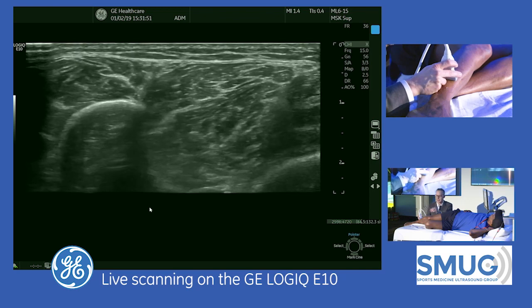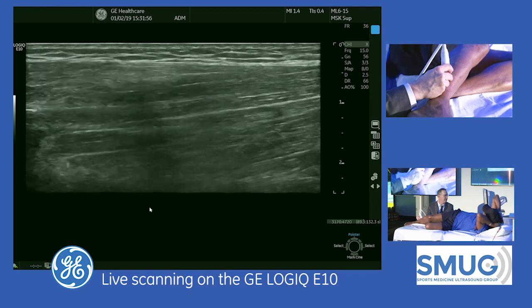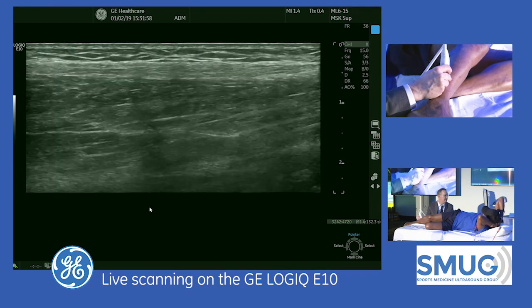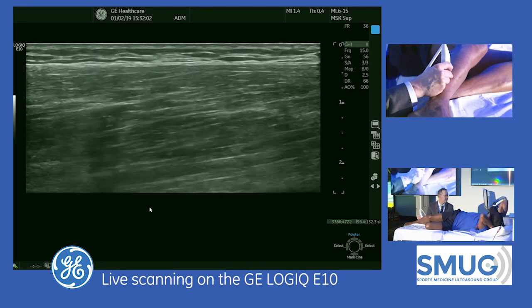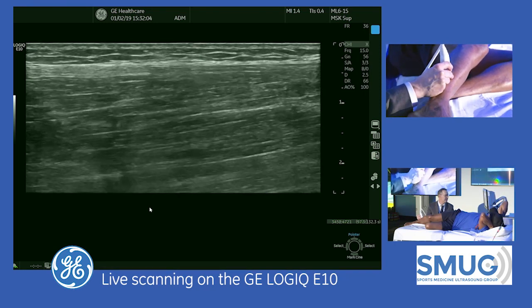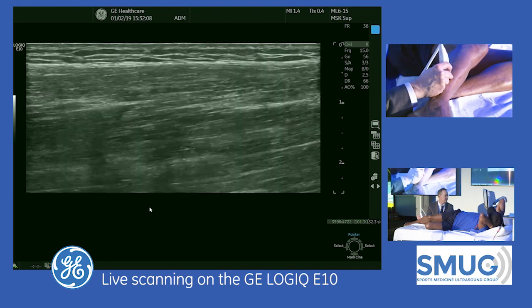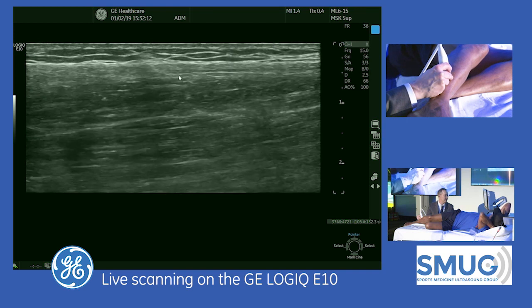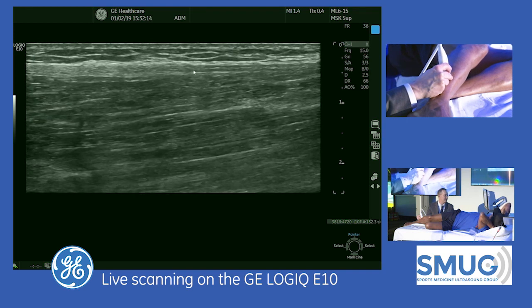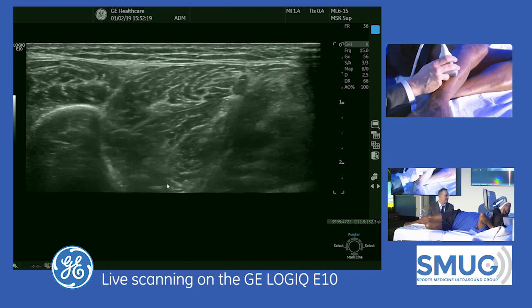You can look at it in long axis, which would show if it were enlarged. But when you look at these tiny nerves in long axis, they almost look like a fascial layer, especially when they're normal. If it's abnormal, it would jump out. That's why we rely on the short axis.